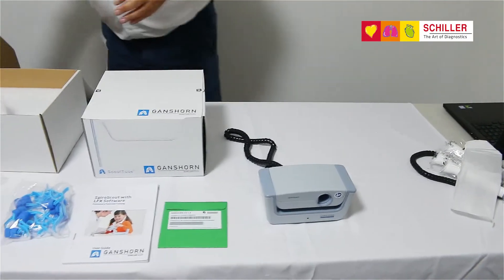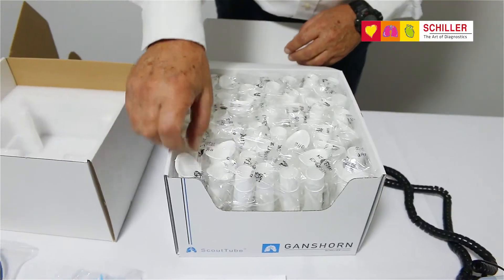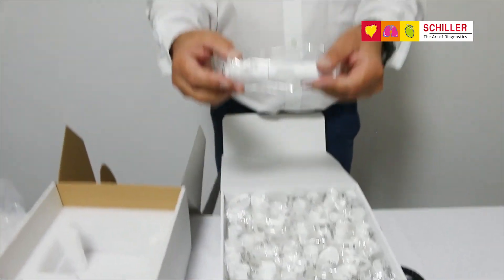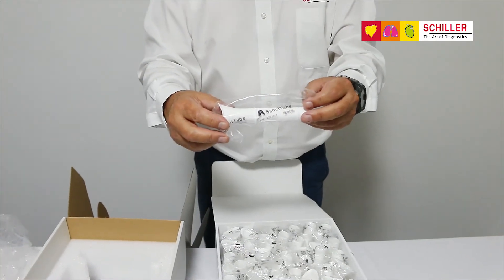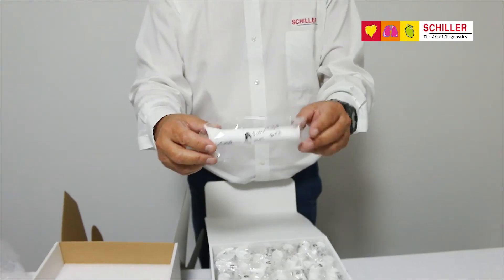The second box contains 50 scout tubes, which are the disposable part for spirometry using the Spiroscout.